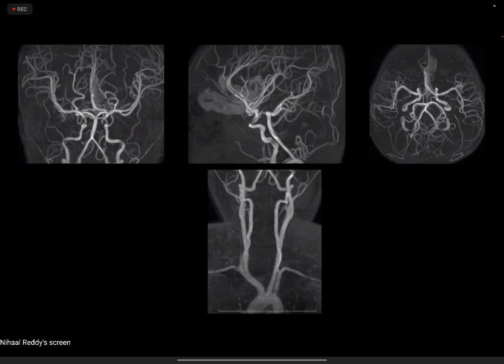Dynamic pituitary function test. Is that an MRI, or is that, Dr. Rajiv, a clinical test? Any idea? No, sir. I will have to look it up. Not sure. I think for starters, maybe look at the entire scan in totality.